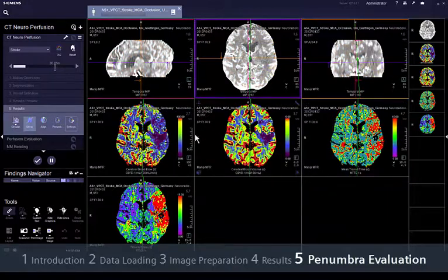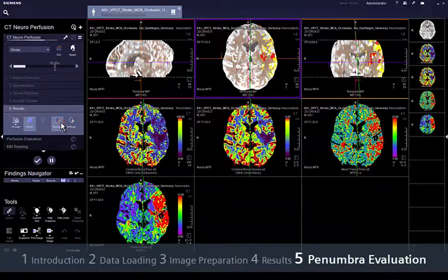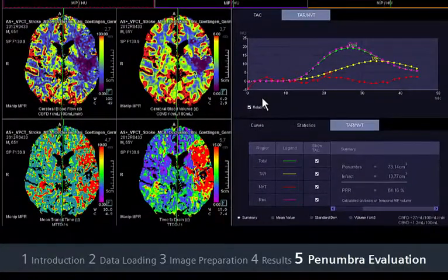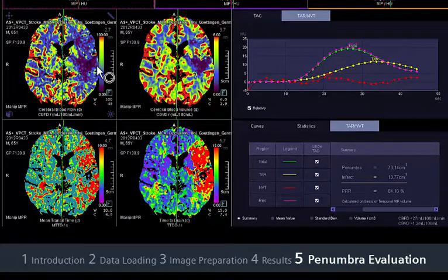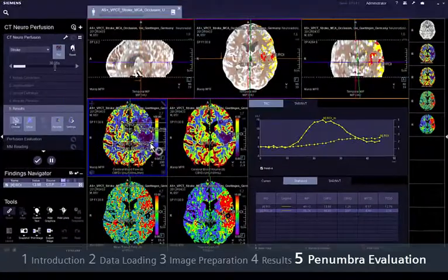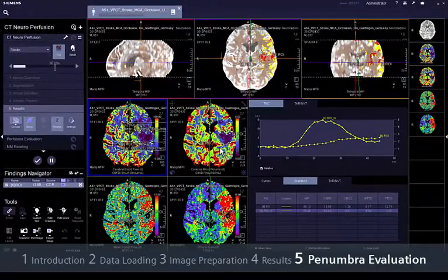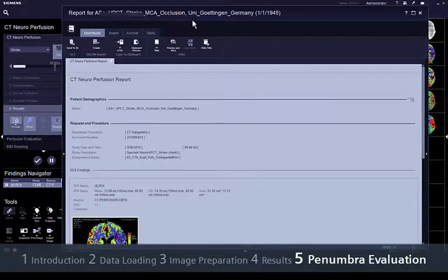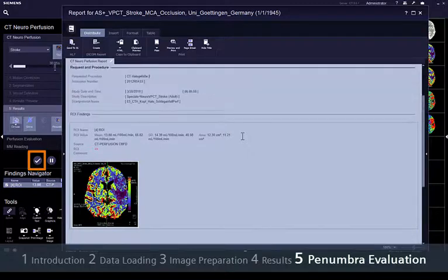To evaluate the penumbra volume quantitatively, just select the ROI tool which will display all of the values in the dedicated chart. ROI measurements will automatically be mirrored to the contralateral hemisphere. All results are conveniently collected in a report. Saving and archiving this report and the results series is as easy as completing the workflow by clicking the Save and Send button.